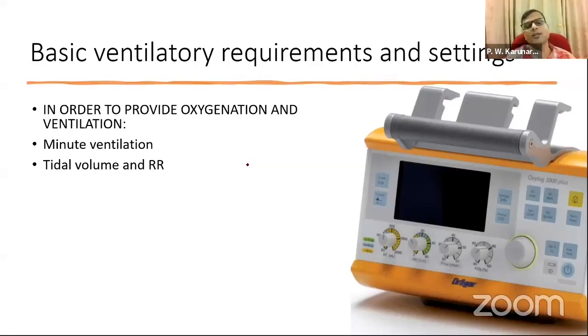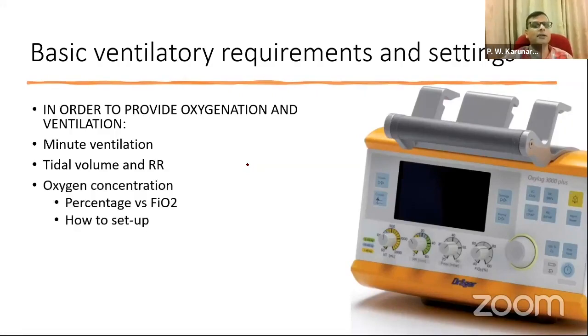So that is what I usually teach. Generally, if you look at a standard ventilator guideline, a non-COVID guideline, they ask you to start with the normal settings: tidal volume 500 or about 8 ml per kg, and a normal rate. But if the patient is too dyspneic, then you have to start with a higher respiratory rate.